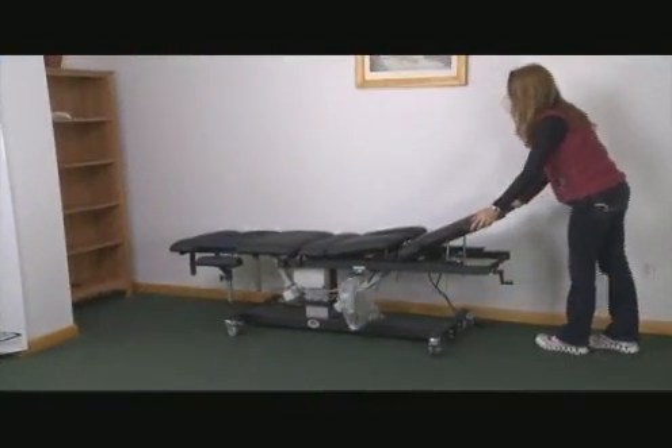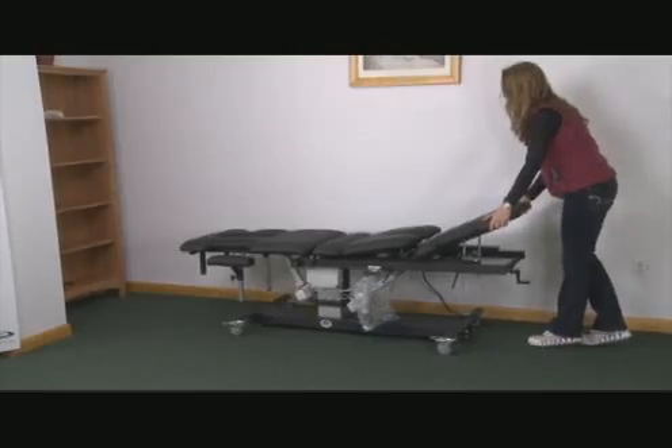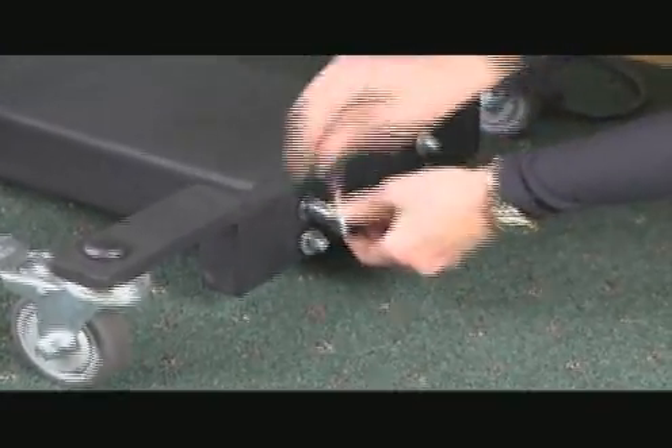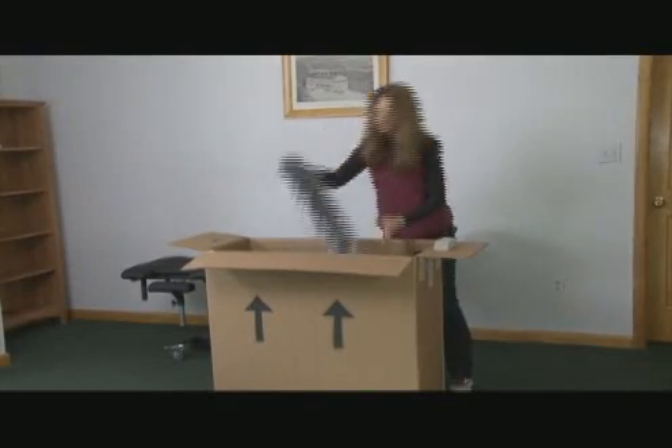After positioning your table in your treatment room, remove the four bolts and washers on the base of the table with a half inch wrench or socket. Open the accessory box and remove the bolsters and base shroud.